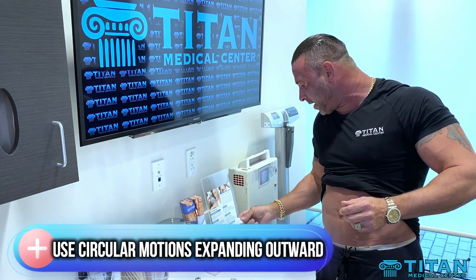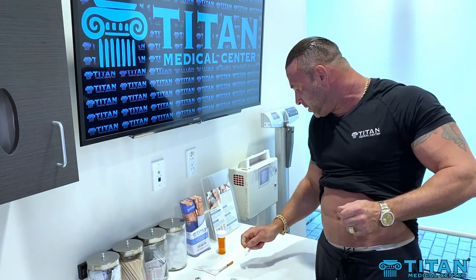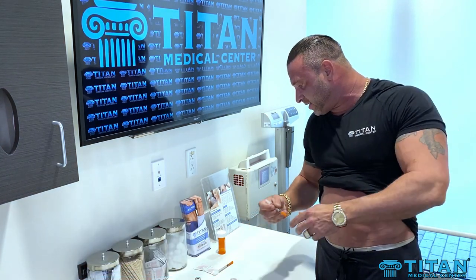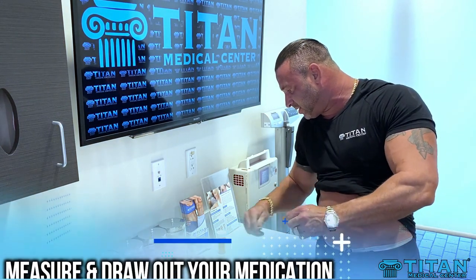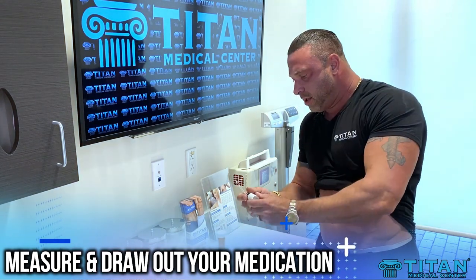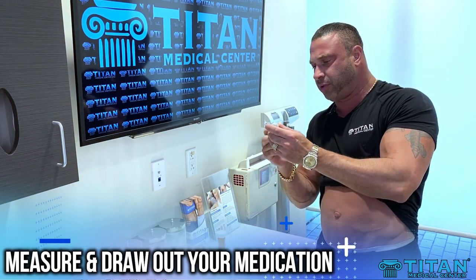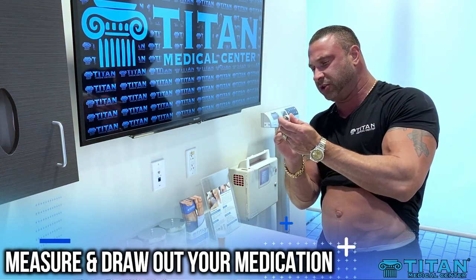I'm not going to touch anything afterwards. The next thing I'll do — and you can do this beforehand too — is make sure you have your medication that's measured out completely for how much you're going to inject.